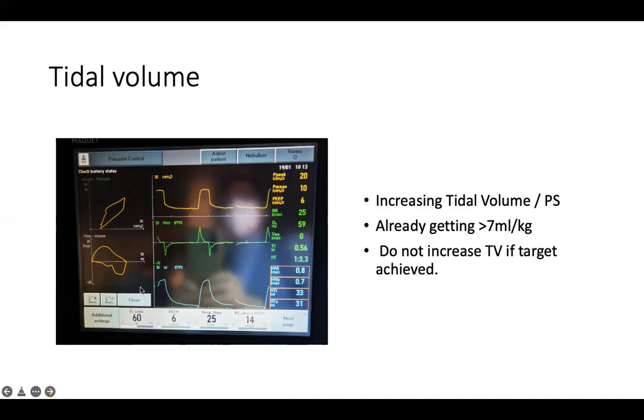So always looking at the settings, you should have that thing in mind. If I'm doing a normal lungs ventilation, that means I should be having minimum settings. If I'm requiring more than minimum settings, then there is something wrong somewhere which I have not identified.